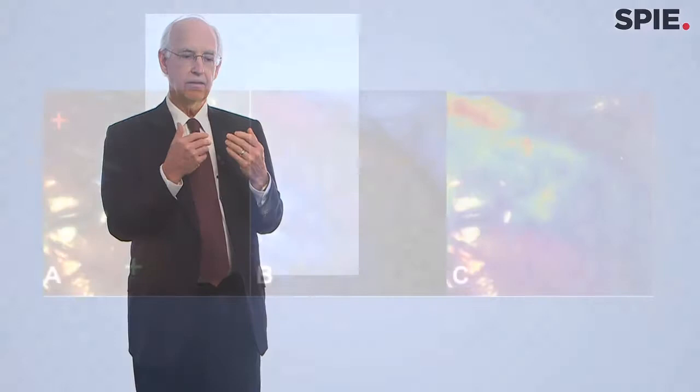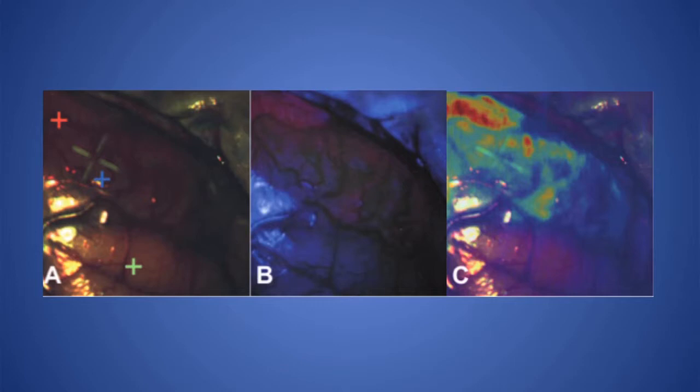The co-registration problem of image guidance, we got into the optics directly out of that project, because the problem with co-registration is that you're taking a preoperative image and co-registering it at the start of the case, and during surgery that surgical field deforms, it gets resected, so that your registration is constantly becoming less accurate. And fluorescent technologies rely on the intrinsic properties of the tissue itself, and if the tissue moves, those biomarkers are moving with the tissue. With fluorescent tissue, if it moves, that guidance remains very, very accurate. So it's complementary to image guidance.